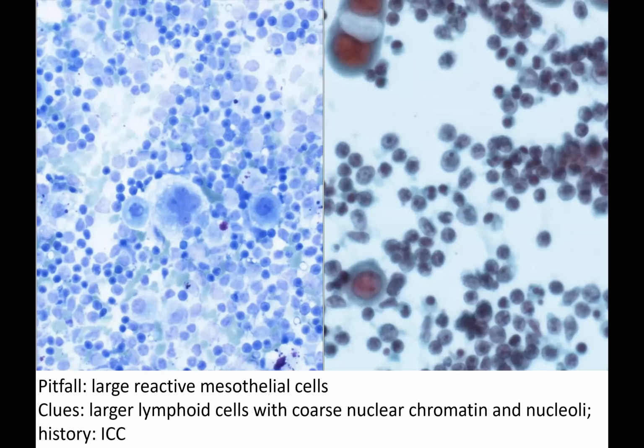And we can see, looking at the cytology, the first thing that strikes us are these large reactive mesothelial cells, and they really catch the eye. So you do have to remember that pericardial fluids in particular can contain very florid reactive mesothelial cells and can be a bit of a pitfall. However, on close inspection of the background lymphoid population, we can see that they're morphologically atypical. They're larger, they've got coarse nuclear chromatin, and many have a nucleolus.